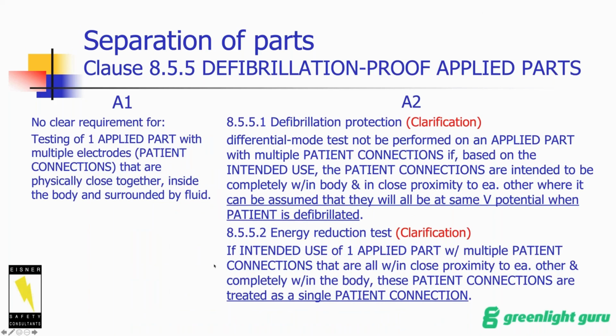And this is actually the item that I submitted to the committee for consideration, because I had a client that came to me, it must be at least 7 or 8 years ago now, probably closer to 10 years ago, that went to a lab. The lab kept testing and failing and testing and failing, and they finally threw up their hands and came to me and said, I'm really frustrated with the lab. What can we do? We looked at it and said, the lab's testing this wrong. We argued for a while and finally convinced the lab that they were testing it wrong.